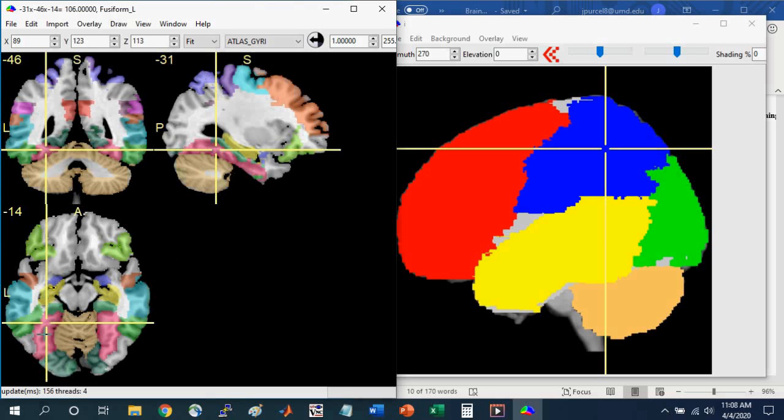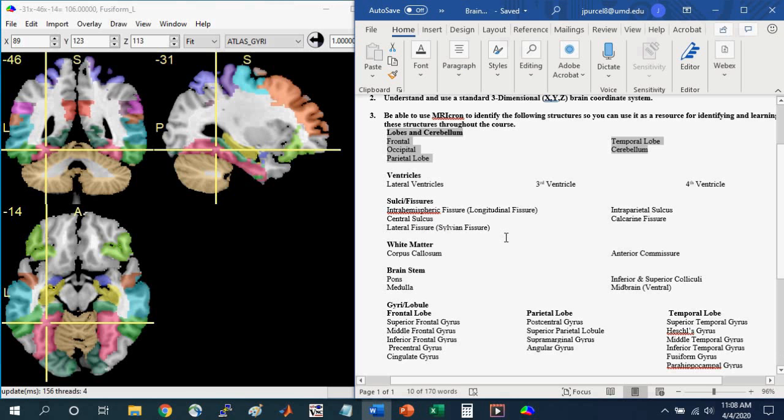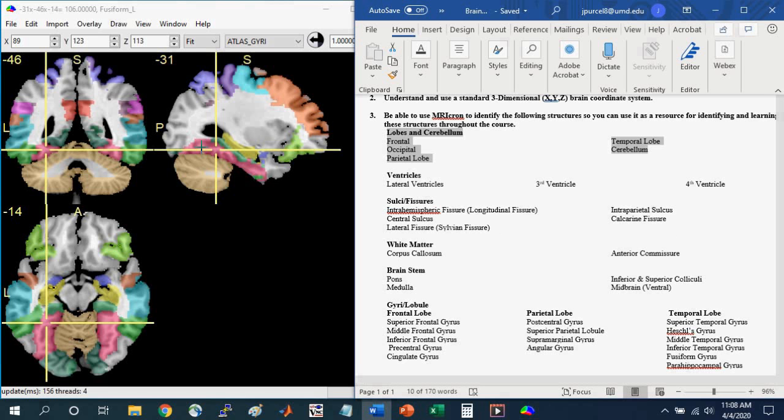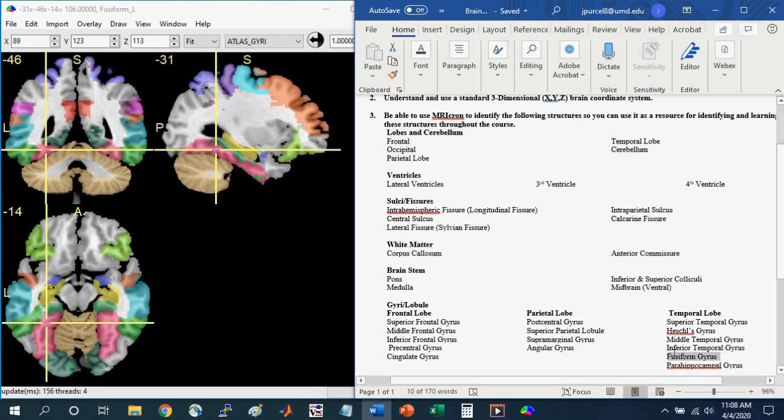So there are colors associated with the specific gyri that would be good for you to know. And if you go back to the learning guide, you'll see that all the structures that are listed here are colored in the atlases that I've provided. For example, where the cursor is here at this crosshair, you see that this is in the left fusiform gyrus. And you'll see that this is on the list down here.